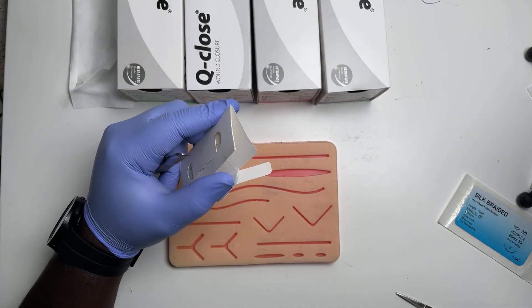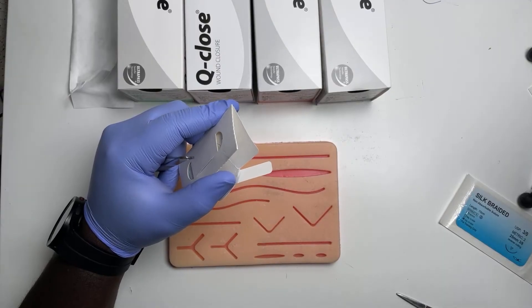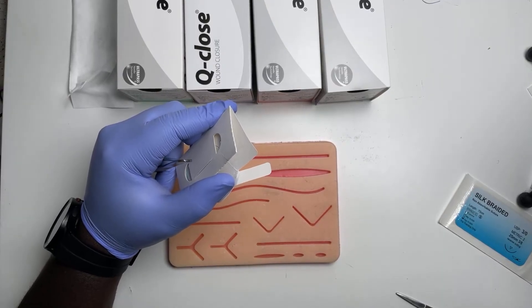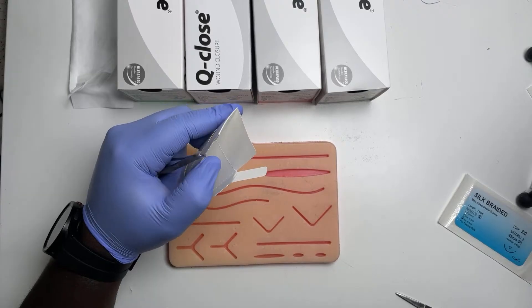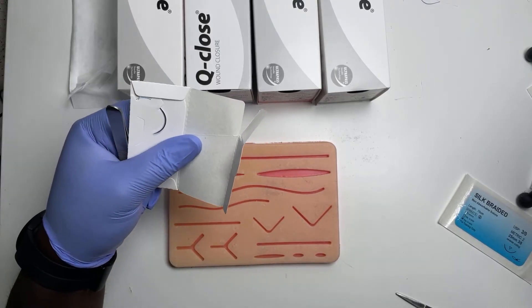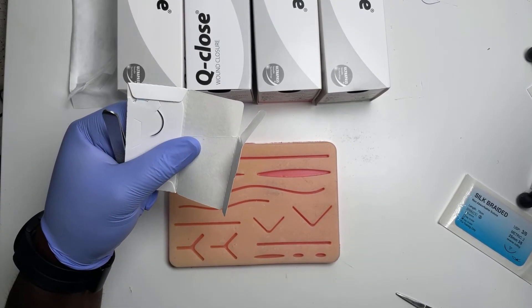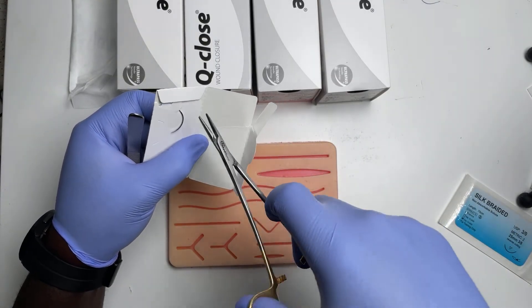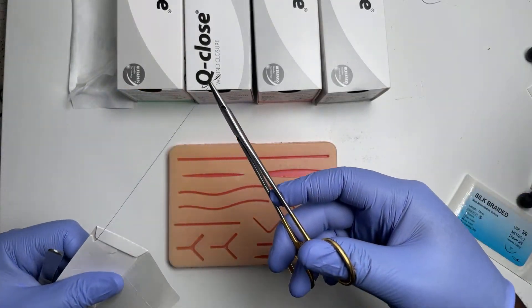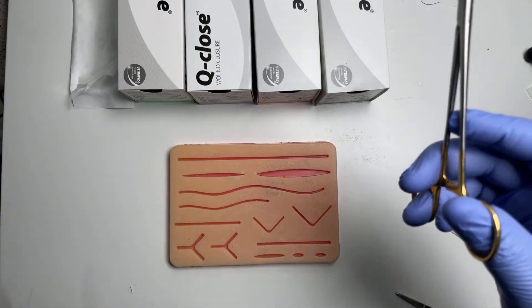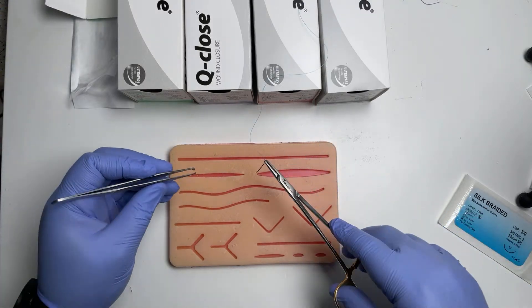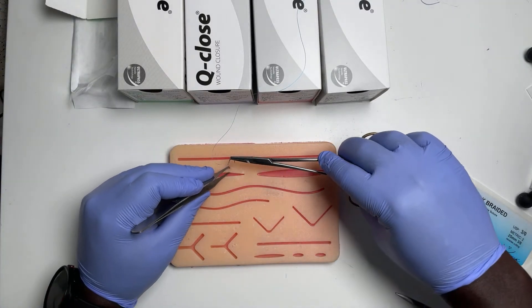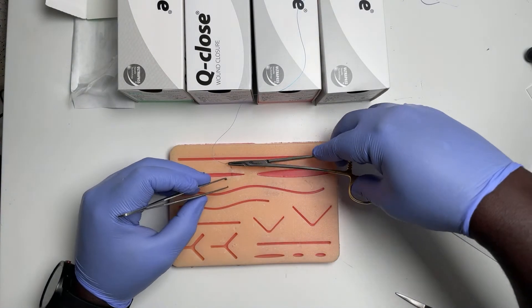So what we want to do is take out our needle holder, take it out like this, and pull the packet away. You're going to go in at 90 degrees and rotate.